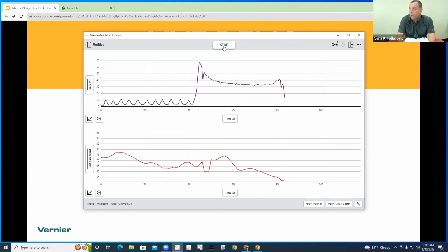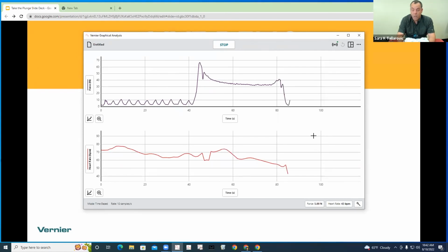All right. Good job. And you can see just from the data that we're recording as we are looking at it, before we've even analyzed it, you can see that he was definitely on one of those downward runs of heart rate declining, probably not as extreme as the actual ice water, but definitely going in the expected direction for cold water on the face.